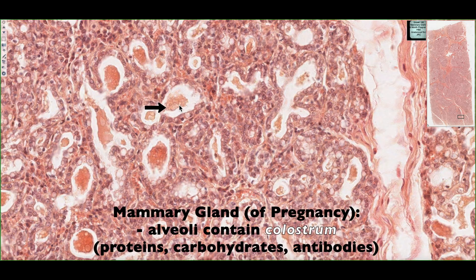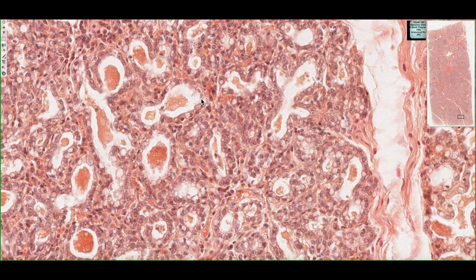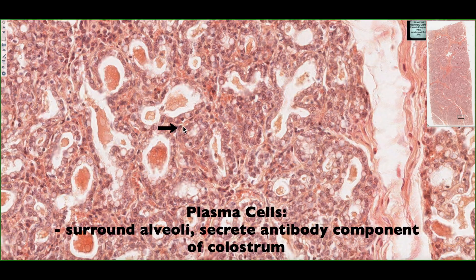We can see that the alveoli have a secretory product accumulating in their lumens. This secretory product is called colostrum, and it contains a high amount of proteins, carbohydrates, as well as antibodies. Some of the cells surrounding the alveoli have white, almost vacuolated spaces — they actually contain fatty droplets. So even though colostrum has a high component of proteins and carbohydrates, it also has a lipid component. One important cell visible here is the plasma cell, which is responsible for secreting antibodies into this colostrum.